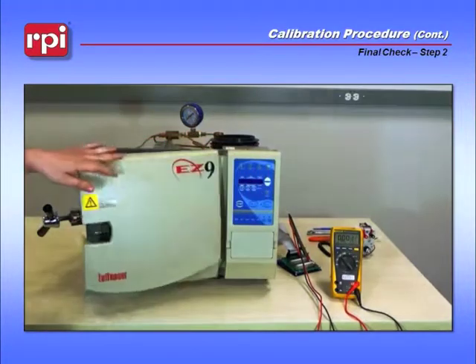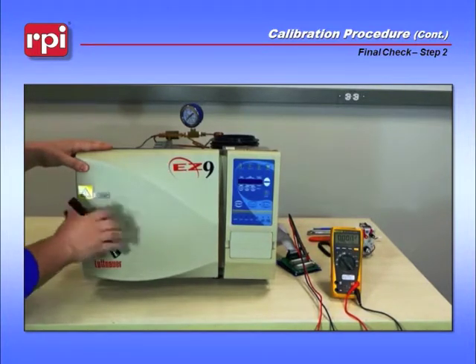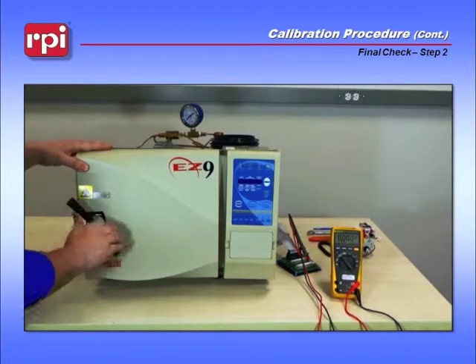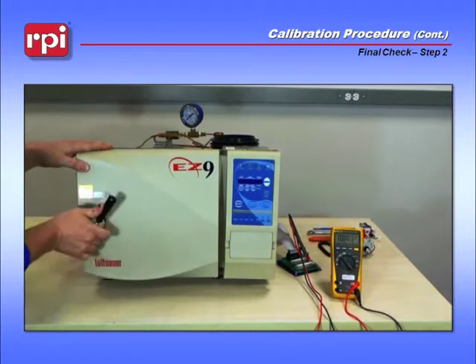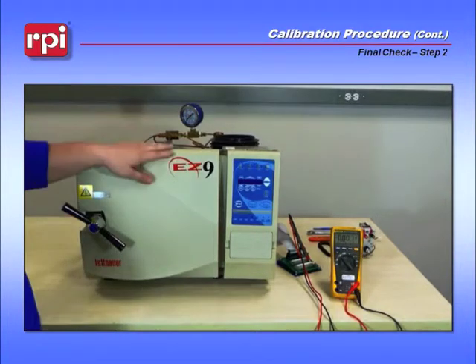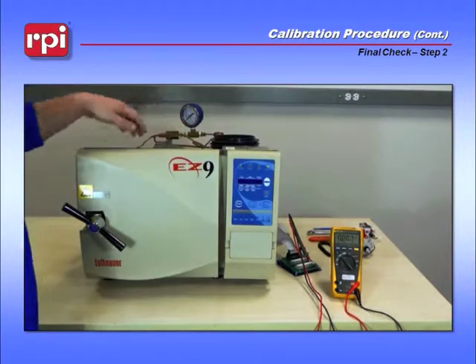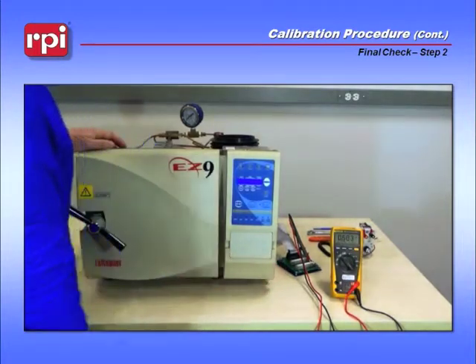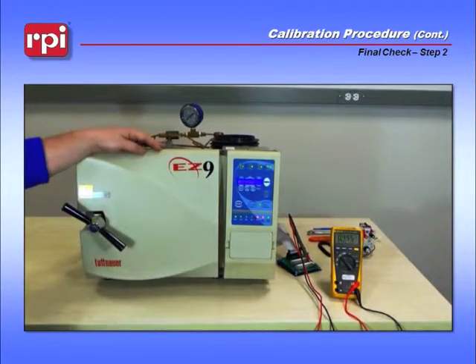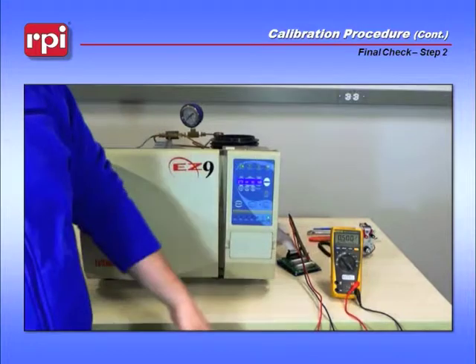Close the door and tighten it all the way down until you can hear the door switch click. Once you've heard it click, verify that your test pressure gauge, the TUG-110, is sitting at 0 psi. Turn the unit on and wait for it to go through its post-test. Once completed, you'll see the 500 millivolts that you calibrated to earlier.